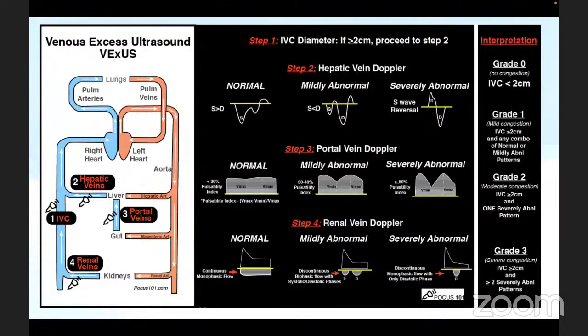If you are unable to perform due to several reasons, like obesity or ascites, something else, or post-operative, can we go directly to step 2, step 3, or step 4? And the other advantage is here we are not measuring any caliper. It is only pictorial appreciation. So this inter-observer variability will come down if you have minimal capacity to do basic ultrasonography and obtain these waveforms.